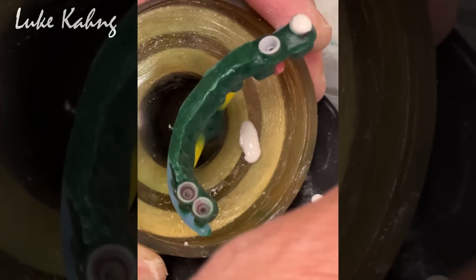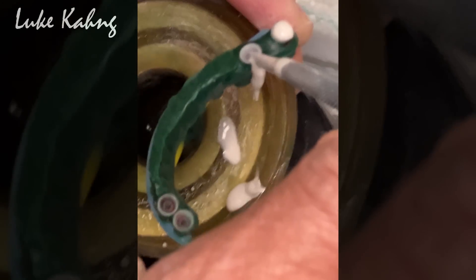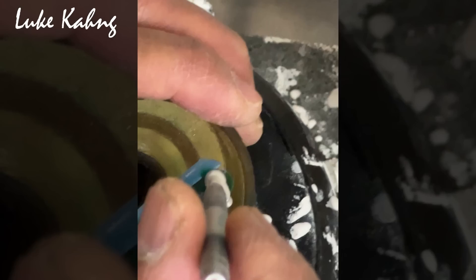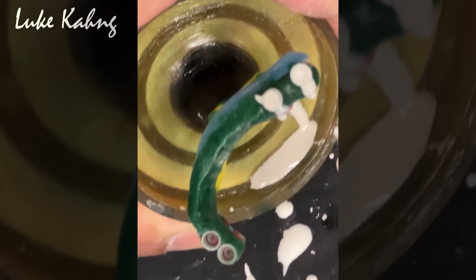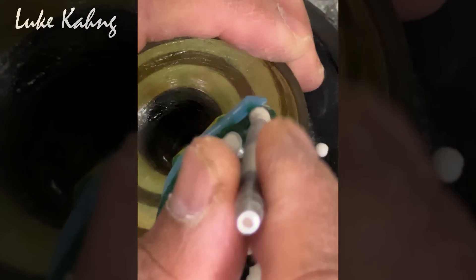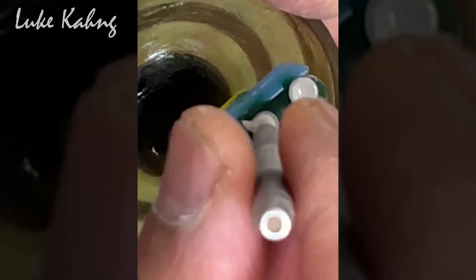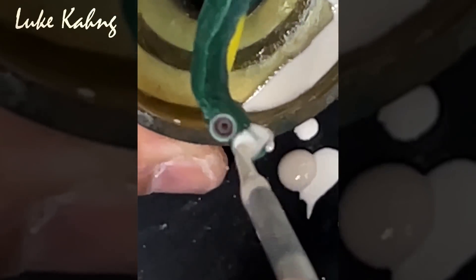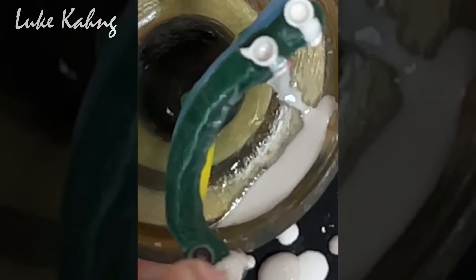This stage is very important — avoid covering all the way down, and make sure there is vibration. Very tiny, very tiny horn. Let's go to that side.